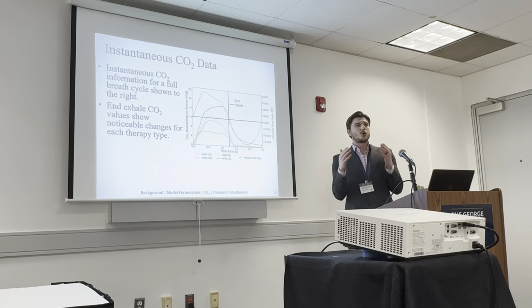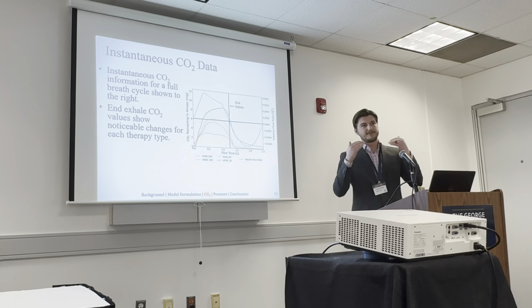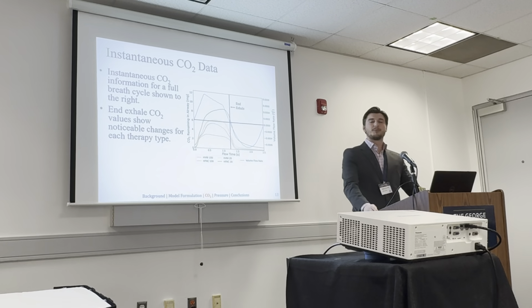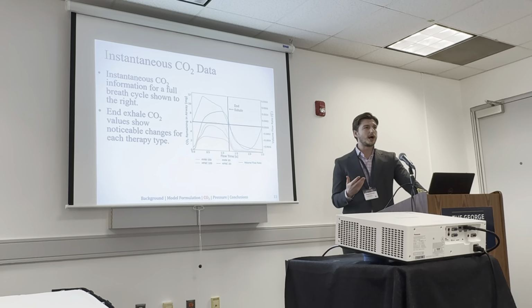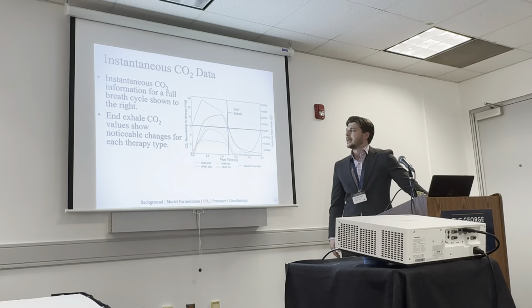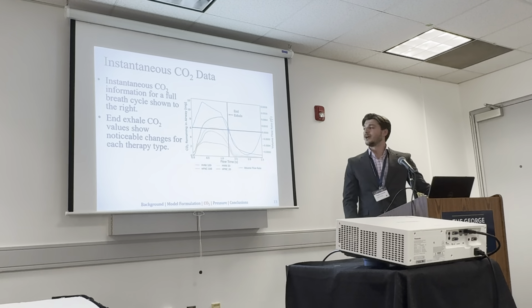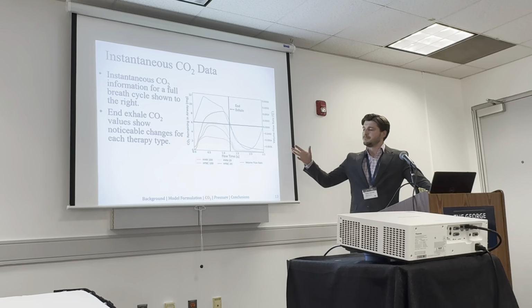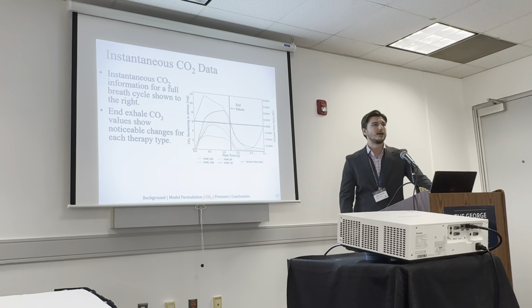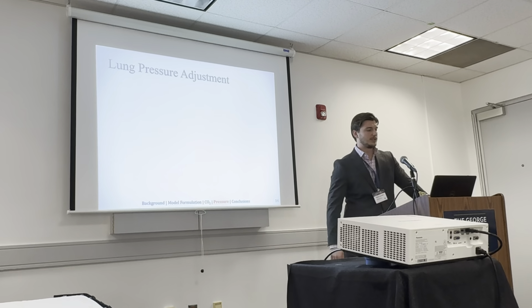So it requires that the volume flow rate actually decrease more before it can begin evacuating that CO2 out of the upper airway. That essentially removes some of the time required for the therapy to recover. So that manifests in this significantly higher end exhale value. Where it was a 1 milligram increase, now it's maybe a 3 to 4 milligram increase because of that closing mouth.